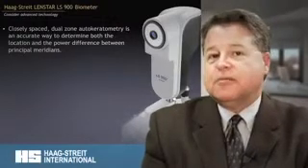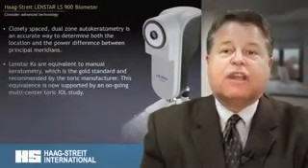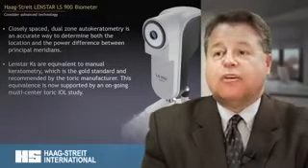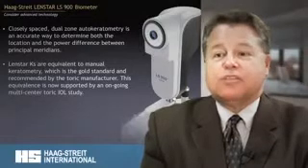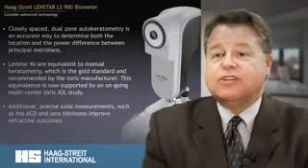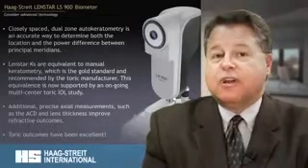So in summary, closely spaced dual zone autokeratometry is by far an accurate way to determine both the location and the power difference between the principal meridians. As I mentioned, LENSTAR Ks are equivalent to manual keratometry, and that is considered the gold standard for measurement of corneal power prior to placing the toric IOL, and this was recently confirmed in a study in the Journal of Cataract and Refractive Surgery. Additional precise axial measurements such as the anterior chamber depth and lens thickness really do add to precision, and our toric outcomes using only the LENSTAR for the preoperative measurements have been excellent.